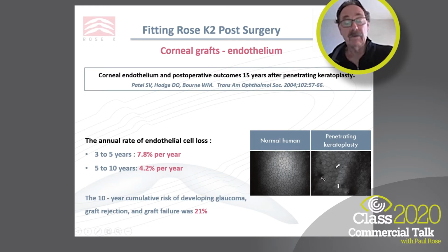Does it stop after 5 years? No, it doesn't. It actually continues to deteriorate. This is another study done up to 15 years. They looked up to 10 years here, and they found that in fact there was a natural endothelial loss on grafts which continued, and this actually increased your risk of rejection, and graft failure occurred in about 21% of cases of graft over a 10-year period. This doesn't sound like much, 7.8% per year, but if you multiply that by 5, you've lost 40% of your endothelial cells in the first 5 years.